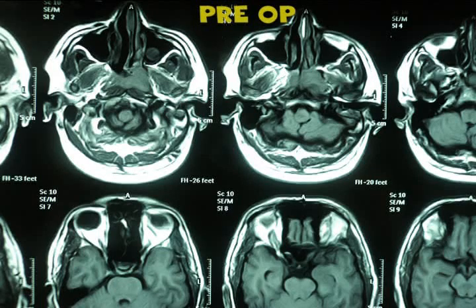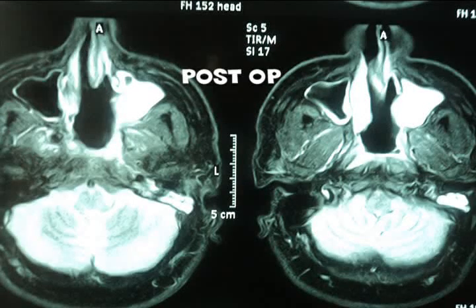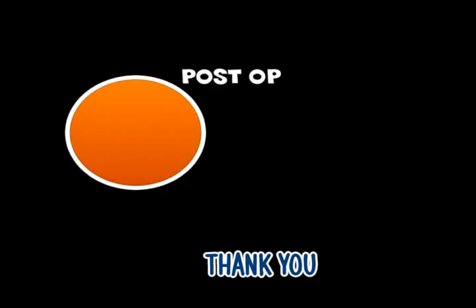That's the preoperative MRI showing a very extensive lesion, and this is the postoperative MRI — the lesion has been totally cleared. Thank you very much.